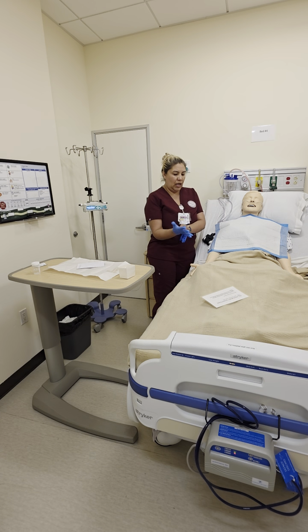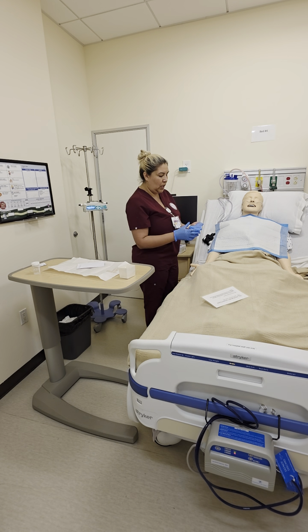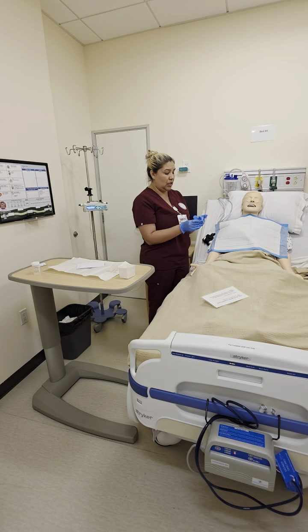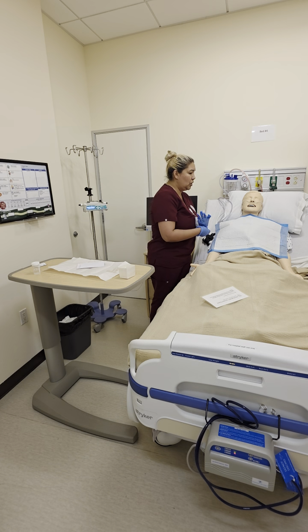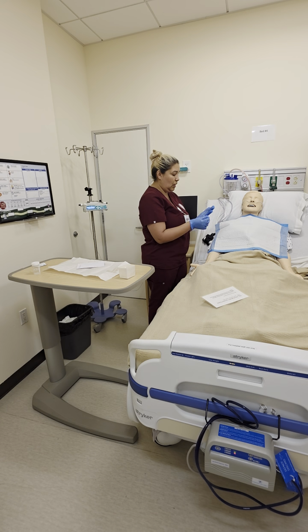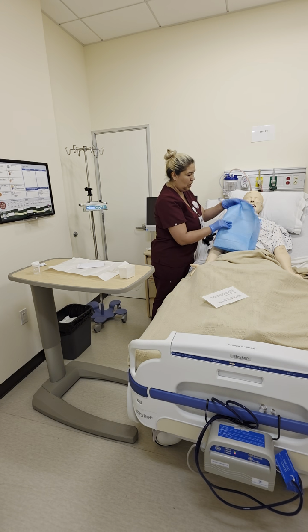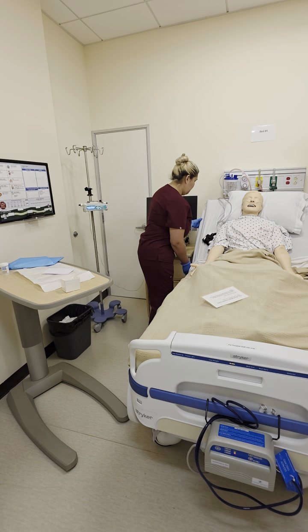I want to make sure that I observe him for any adverse reactions, like increased tachycardia or any bleeding. And also I want to make sure that his oxygen level did not decrease, or that he's not having any cardiac arrhythmias. So I'm going to check his lungs, check his heart while I auscultate his lungs too. Get rid of this and make sure my patient is comfortable. Put this up.